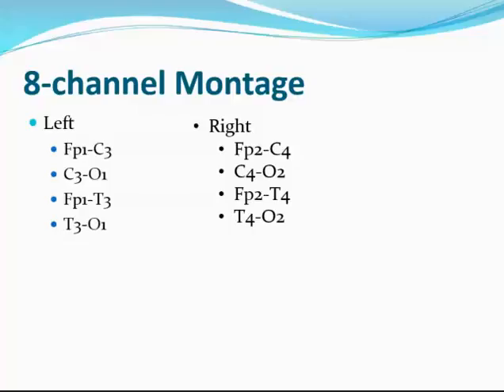We will talk later on about some standards and guidelines that we have here in the USA. You might have different guidelines wherever you are, but the more channels you have, it is generally believed the more you can capture what is actually happening underneath those electrodes. For example, if you're doing a carotid endarterectomy, you're looking at at least 8 channels, preferably 16, even better 21 channels.